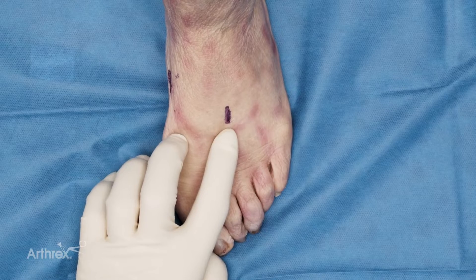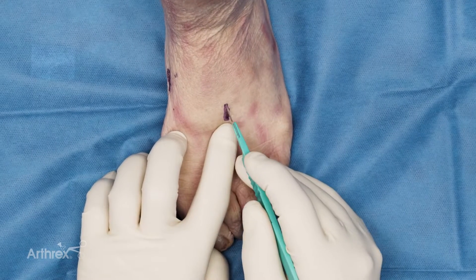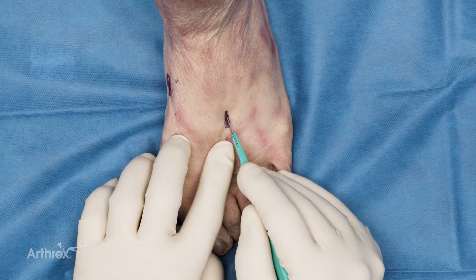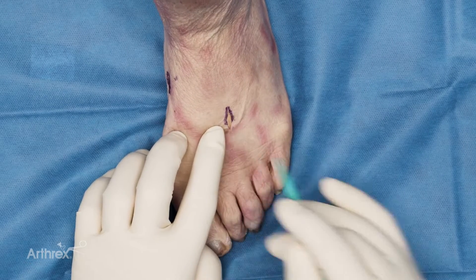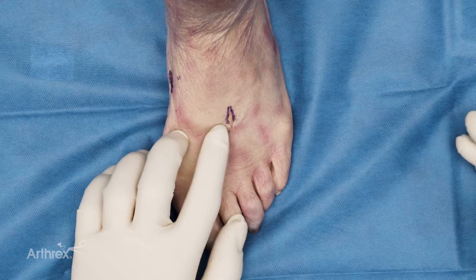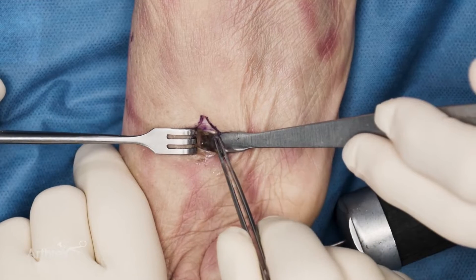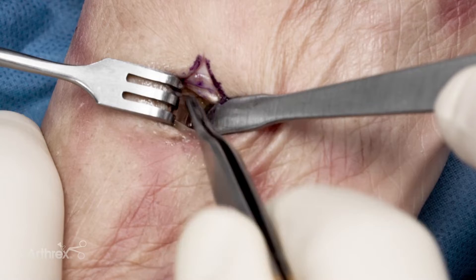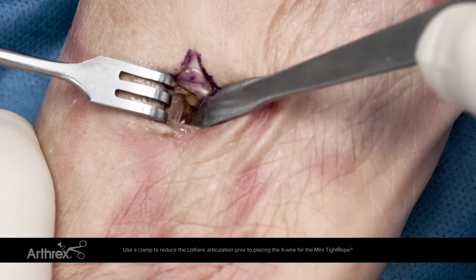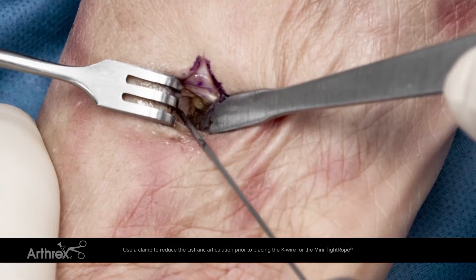I'm going to make my first incision, which is just off the lateral border of the second metatarsal. I'll make my incision long enough so that I can get my mini tightrope in. I'll take some scissors and dissect down. With the Homan on the bottom of the metatarsal and the retractor up on the top, this is the shaft of the metatarsal. I want to make sure I'm in the mid shaft of the second metatarsal, very close to its base.